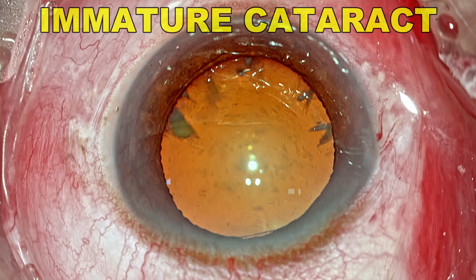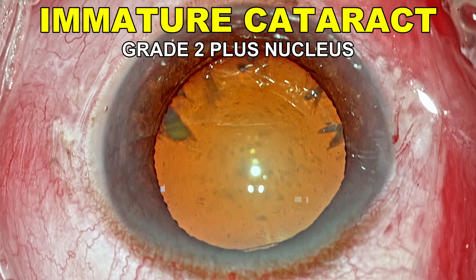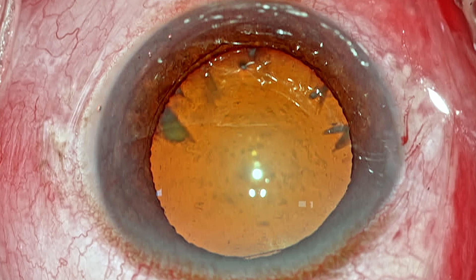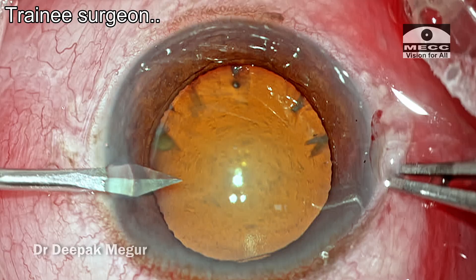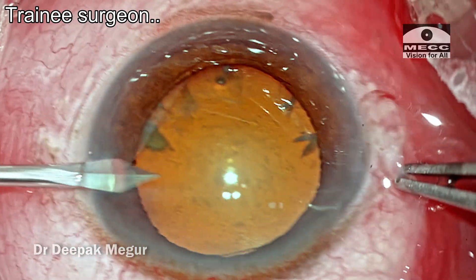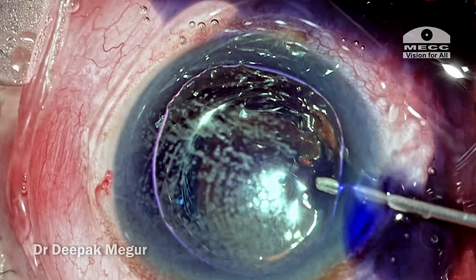This is an abnormal looking eye with an immature cataract which is about grade 2 plus and a well dilated pupil that doesn't seem to be having any issue. The trainee surgeon has begun the surgery, the side port is made, and the dye is being injected under the air bubble — so far so good.